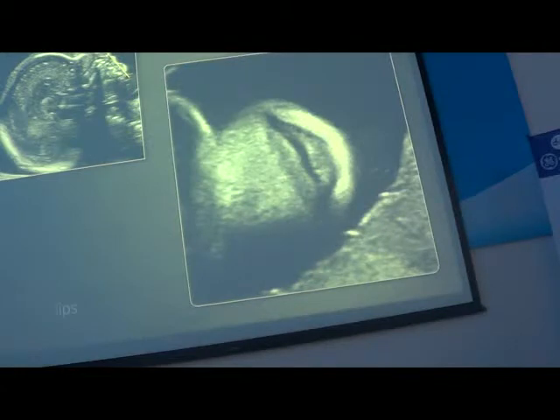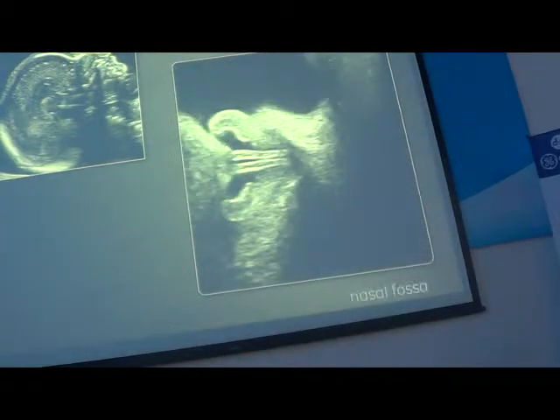And this is a view of the upper lip and the lower lip. Hai bờ môi. And with this, if it's normal, you can exclude a cleft lip. Và với cái đường môi trên bình thường thì các bạn loại trừ được các cái khe hở môi. This is the nose with the nostrils, the nasal fossa and the septum. Với vách mũi, các lỗ mũi.